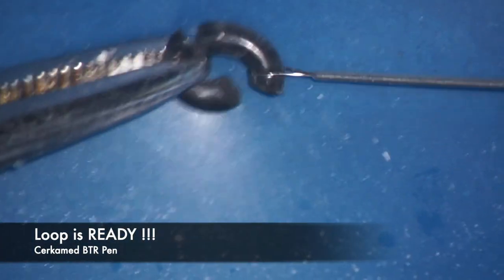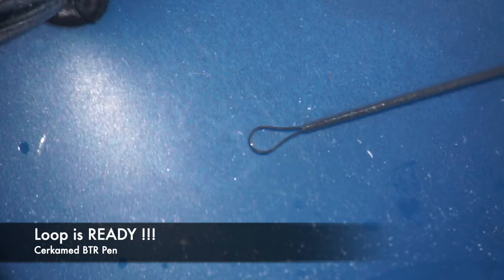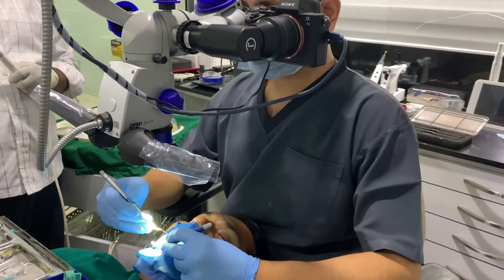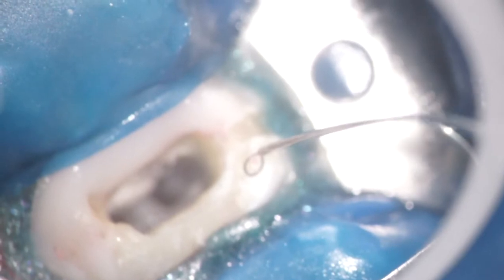After visualizing the head of the instrument, we move to another retrieval device known as the BTR pen, which is a loop-type device. Here we are preparing the loop so that the head of the instrument can be grabbed.